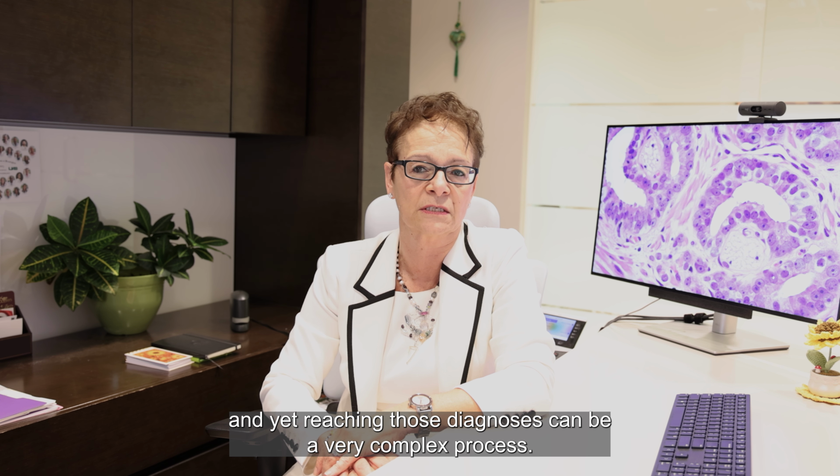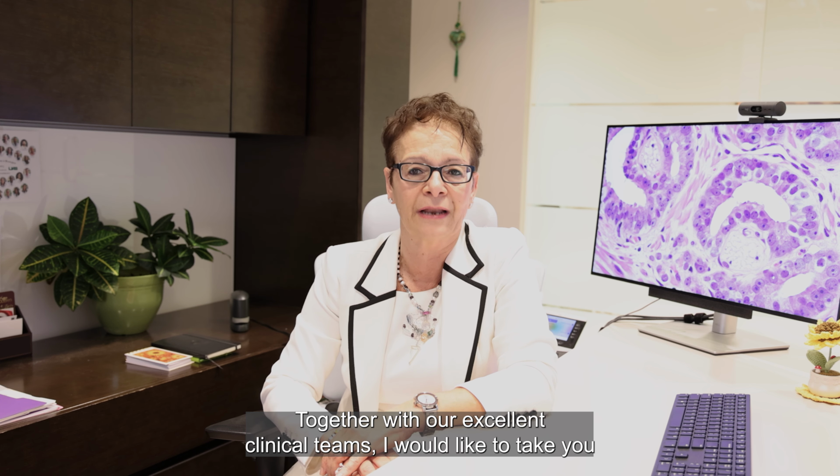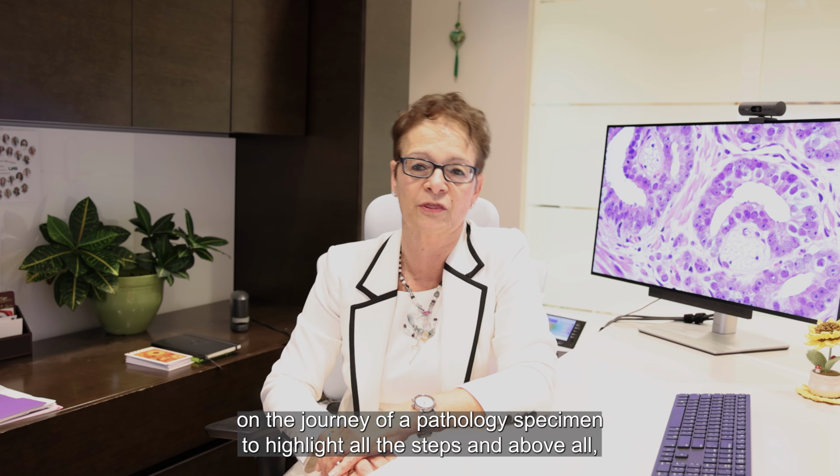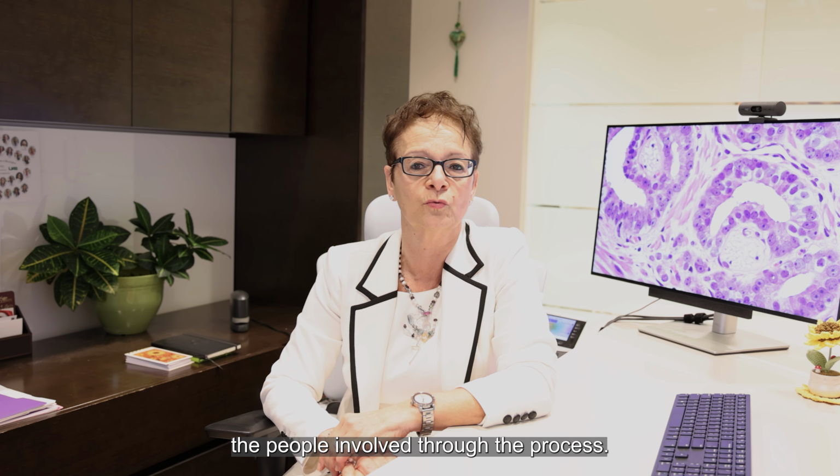Timely and accurate diagnoses are critical to determine the best treatment options, and yet, reaching those diagnoses can be a very complex process. Together with our excellent clinical teams, I would like to take you on the journey of a pathology specimen to highlight all the steps and, above all, the people involved through the process.